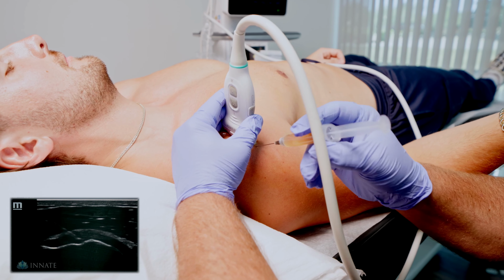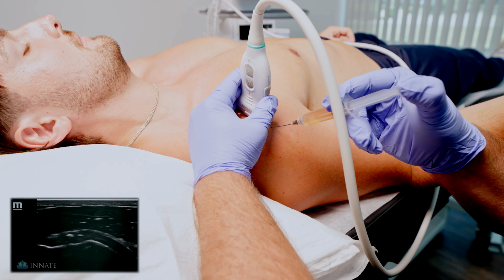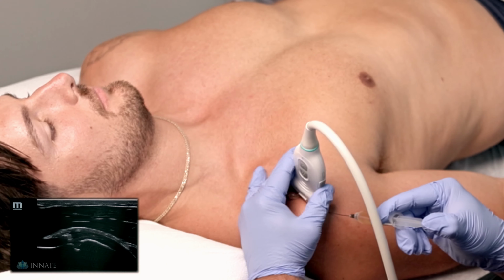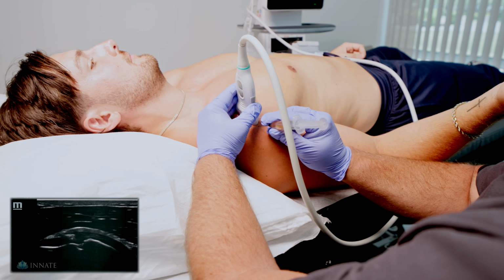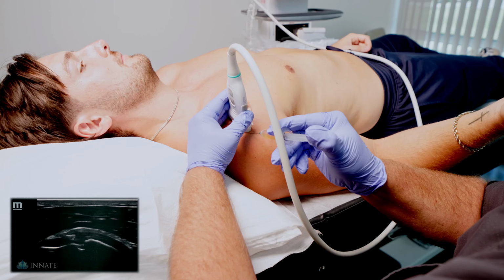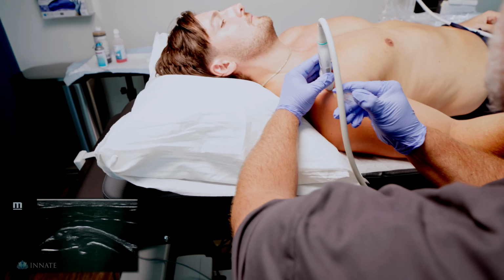And there, the needle's right at that area, that focal area of the cortex, where you have that disruption. We're going to do a little bit of a fenestration. And making a little bit of contact with the cortex here. Stimulate that little bit of additional healing. You might feel a little bit of pressure here.